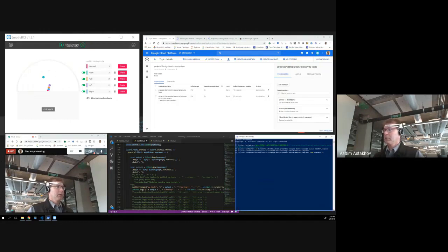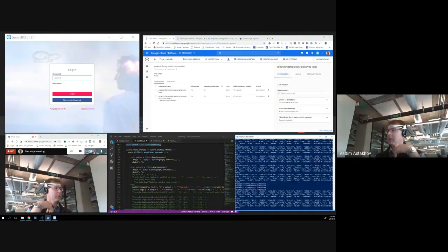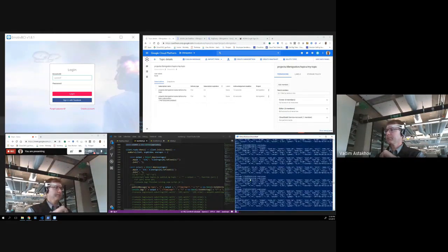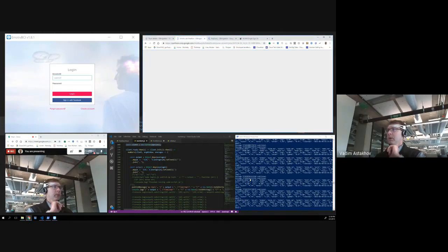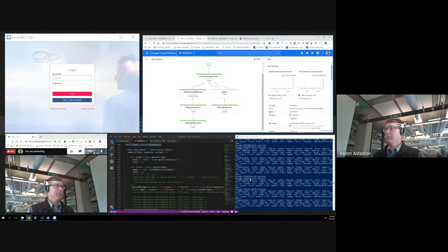Let's run the script, take my data from the device, and publish those messages. As you can see, it's taken in real time. It takes about 10 measures per second. Now that data goes to Pub/Sub, and from Pub/Sub it gets pulled by Dataflow. I created a Dataflow job that reads from the Pub/Sub topic, performs some data transformation and cleaning, and stores it.